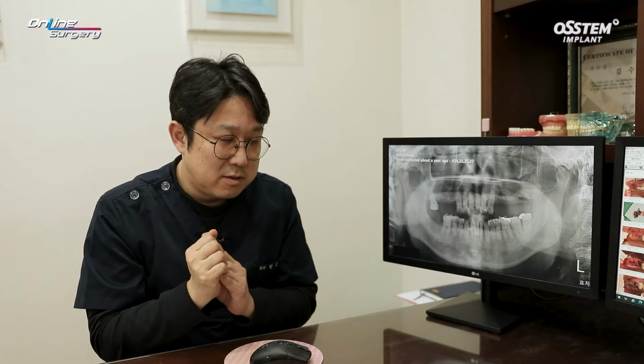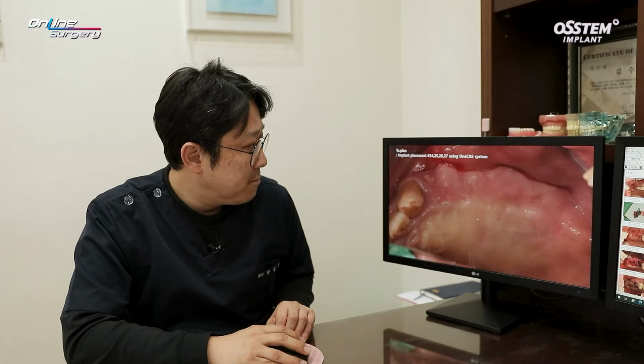When doing crestal approach in inclined areas, in one part it can be penetrated, but for the rest of it, there can still be no penetration. So it's very difficult to determine if the sinus floor has been penetrated or not. The best way to do it is to do it gradually, moving forward by 1 millimeter using hydrolift. You need to be very patient, and this can be a very tenacious job. Patience is the key here. This is something that needs to be concentrated on when doing implant surgery.